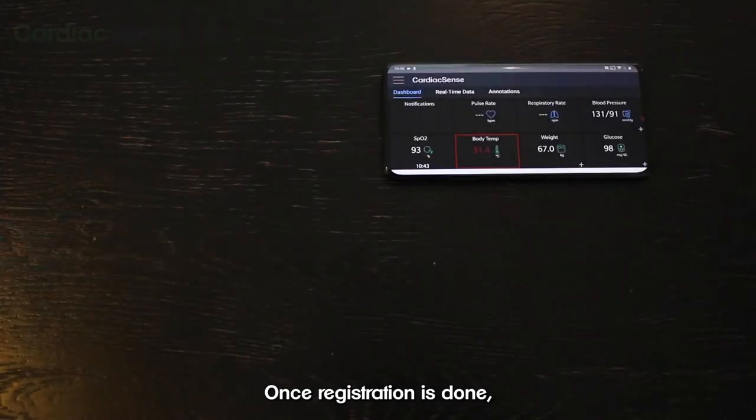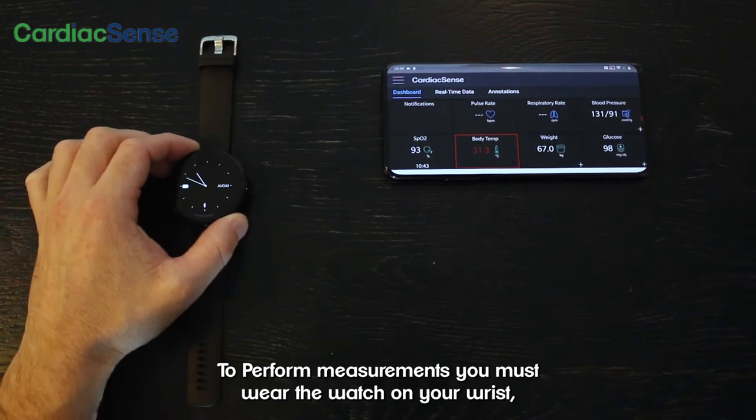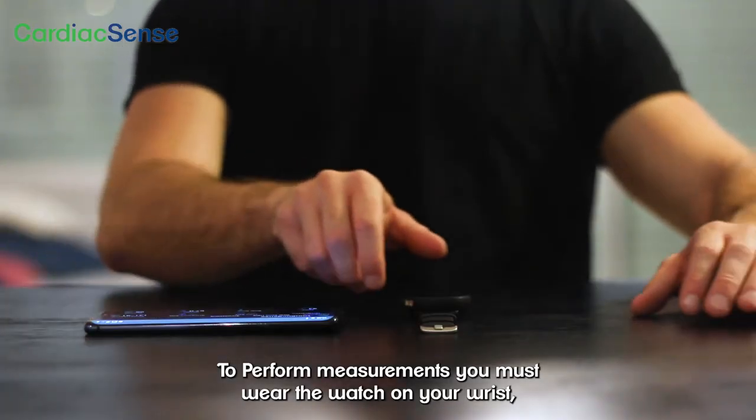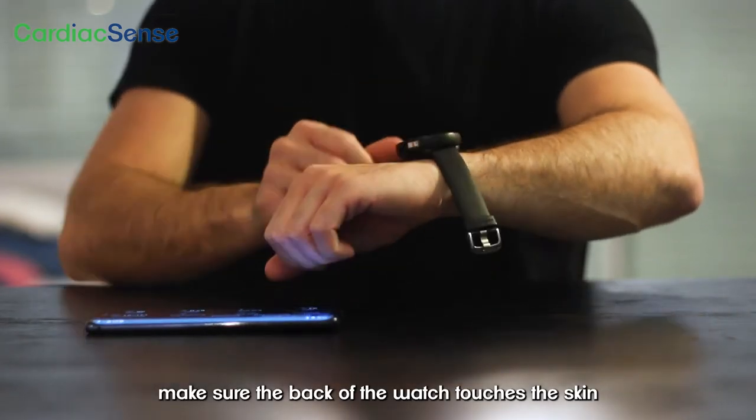Once registration is done, you can start your first ECG measurement. To perform measurements, you must wear the watch on your wrist, not too loose nor too tight. Make sure the back of the watch touches the skin.